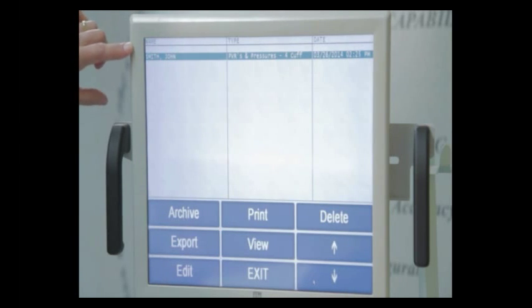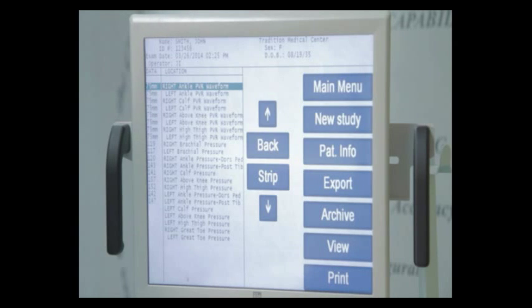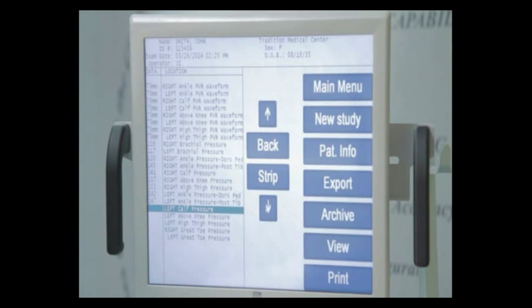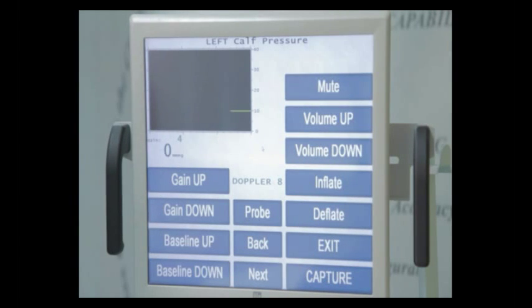If you have multiple patients in your temp file, it's going to be the very last one there. Highlight that and press the Edit button. This will now take you to the Edit screen, and in the column here on the left that says Data, anywhere there's information means that that step has been performed. So we go all the way down using our down arrow key, and we're going to highlight left calf pressure. That has not been done yet, and we're simply going to press back. We're going to pick up right where we left off.